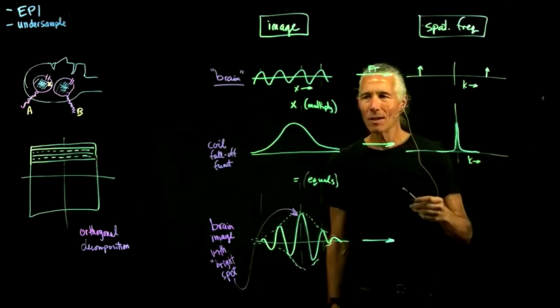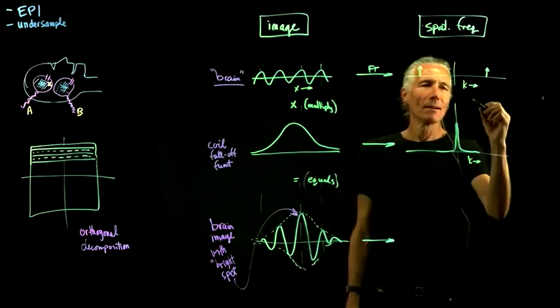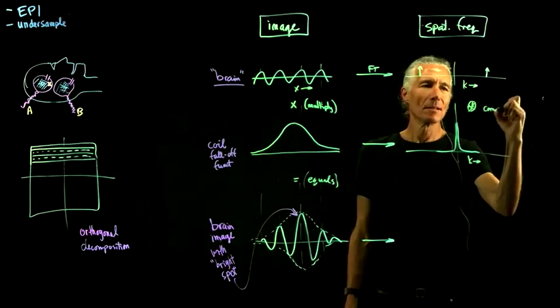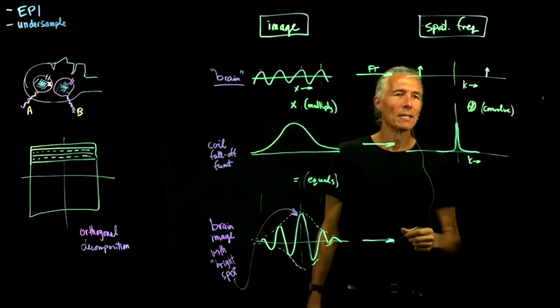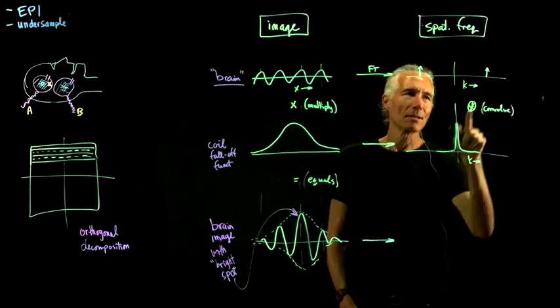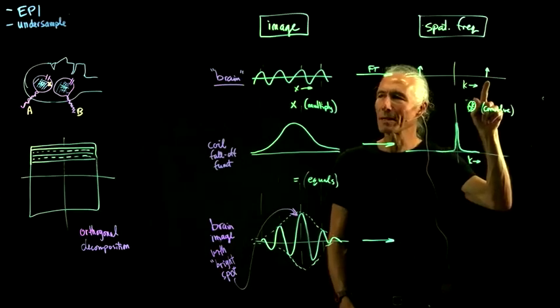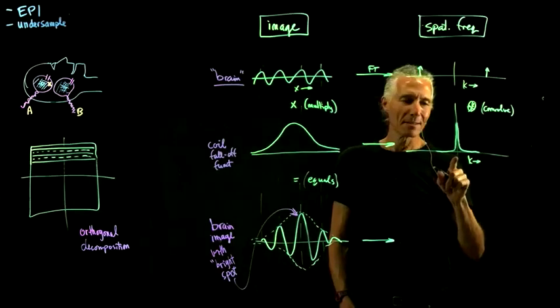And so now we're in the other domain. So instead of multiplying, we convolve. What happens when we convolve with a Gaussian? This is like your Photoshop filter. So here's your Photoshop image. It's just got two spikes in it, and you convolve it with a Photoshop filter that is like a narrow Gaussian.